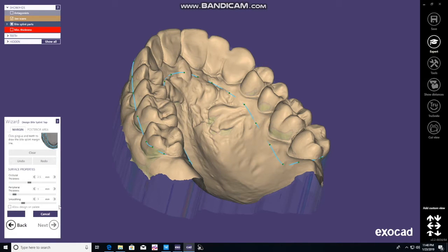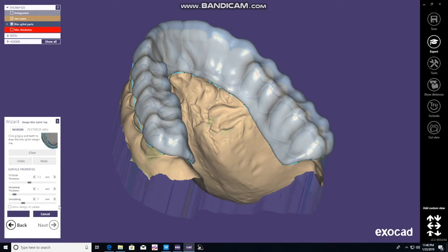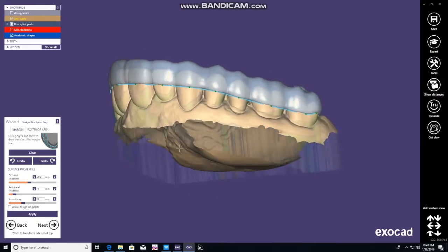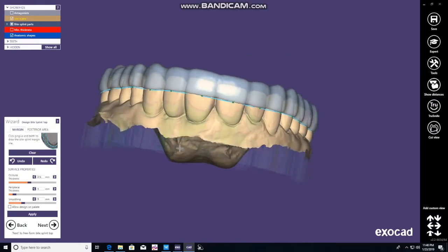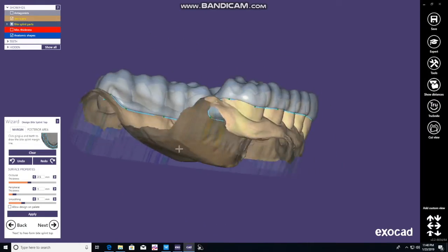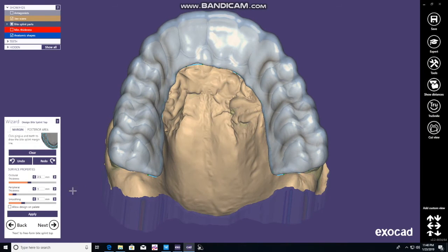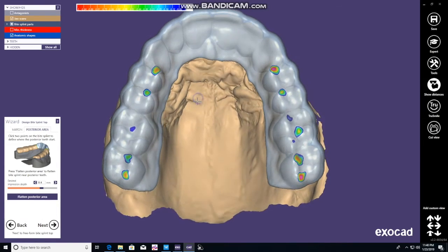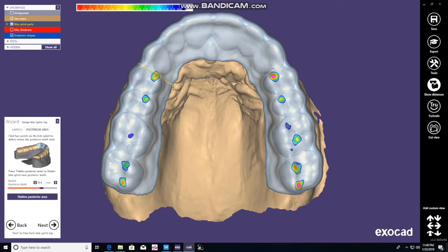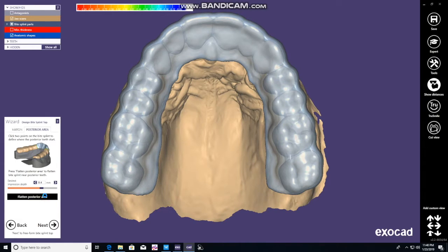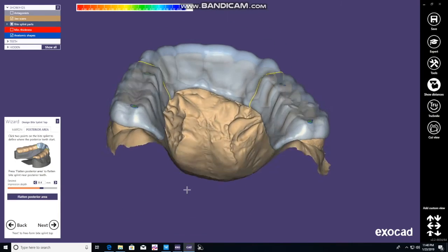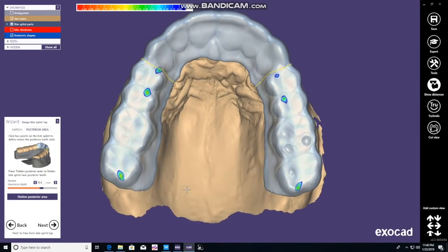The nice thing is, next you can edit this. You can see those little dots — if you don't like how it looks, if it doesn't look even and symmetric, you can move those points around and reapply. In this case we liked it. Now we're selecting the posterior areas, and you can click to flatten the posterior area so there are no interferences.